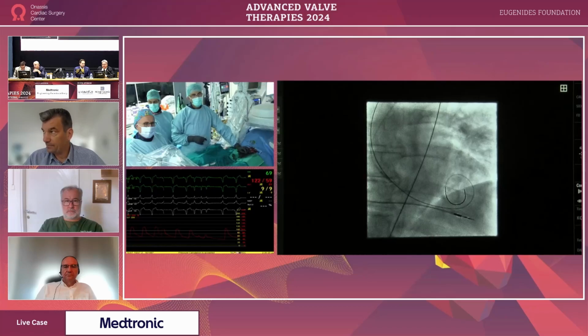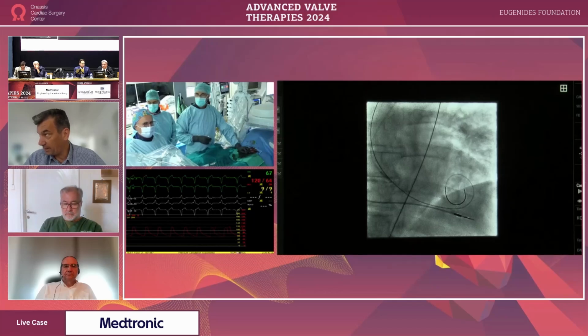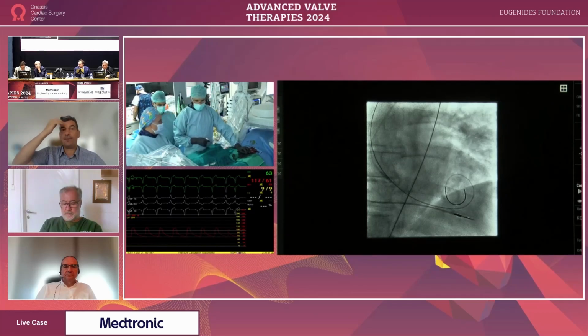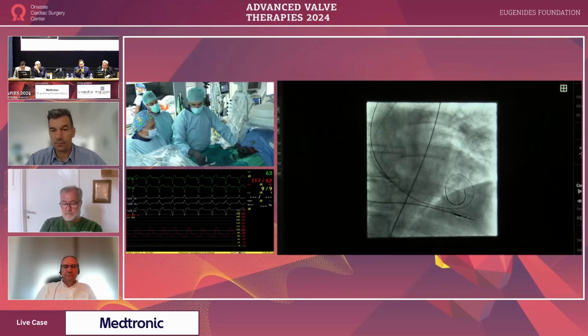If this is a patient that you can implant about 4 millimeters depth with no danger of RBBB, etc., and according to the sizing, of course. So I think that you know the case, and whether or not to predilate is not just how much calcium and how stenotic it is, but the chances and the need for post-dilatation and what it means.